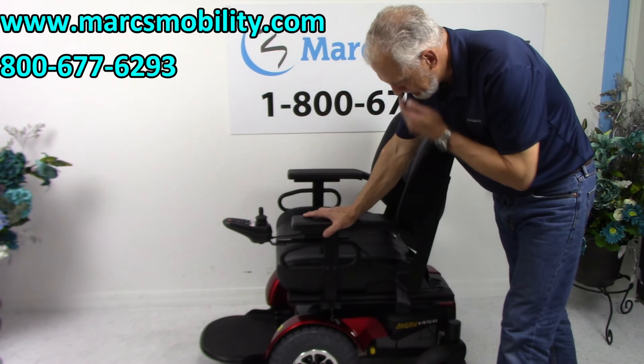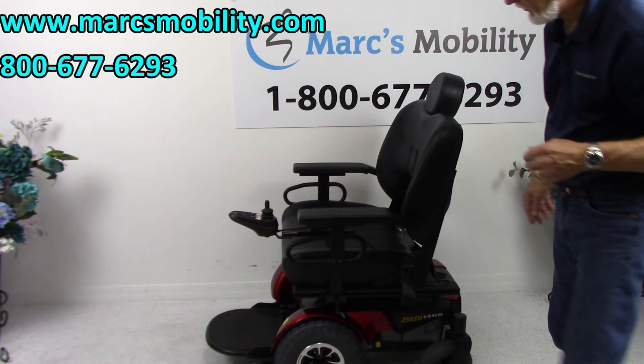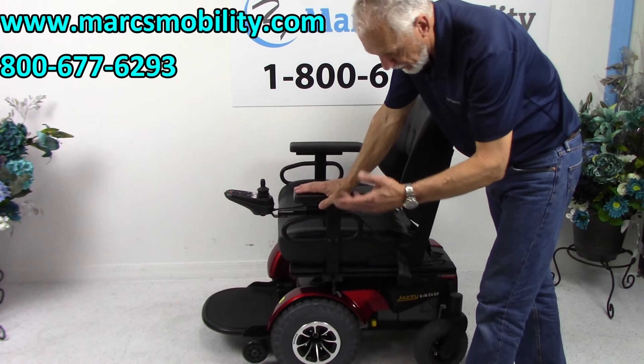This chair was only used for one hour, so it has one hour of running time on it — it's essentially brand new.